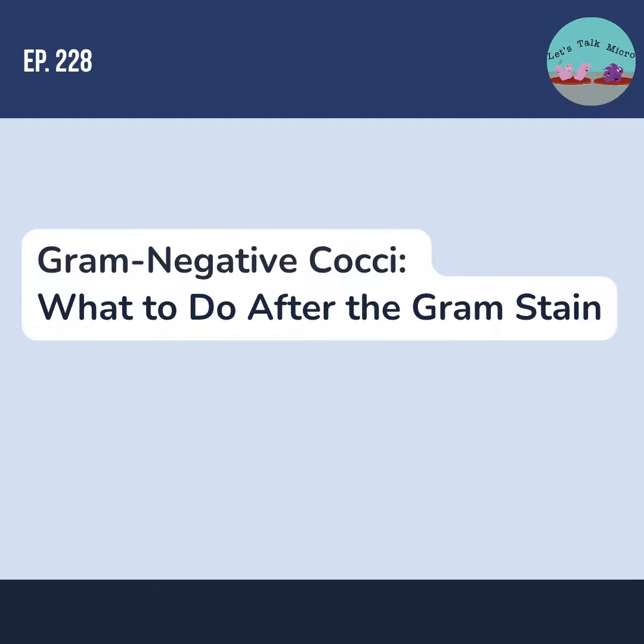So let's spend a little bit of time talking about collection and transport because it might help you if you're taking the certification test. If Neisseria gonorrhoeae needs to be ruled out for the collection, the recommendation is to use rayon, Dacron, or nylon tip swabs, one of those three.